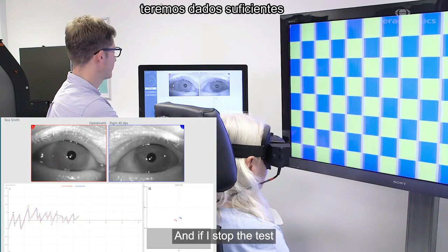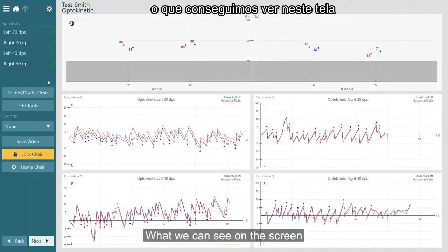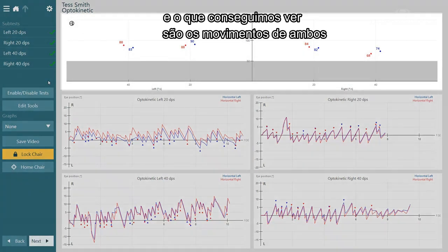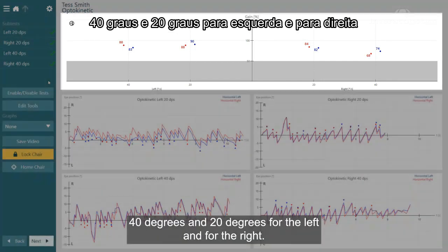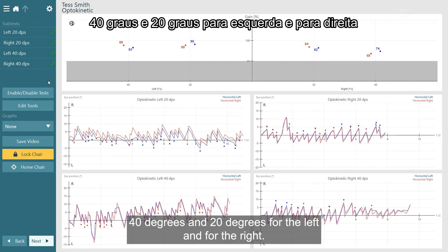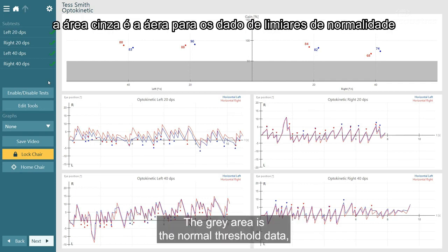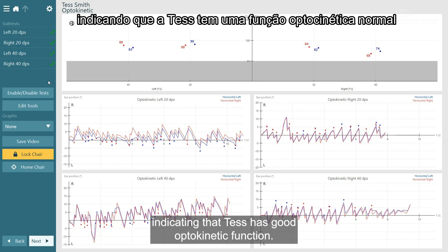If I stop the test here, we have sufficient data. What we can see on the screen is both the raw tracings on the bottom and the gain values at the top. We can see the movements at both 40 degrees and 20 degrees for the left and for the right. The gray area is the normal threshold data, and we can see that Tess's responses are well above that line, indicating that Tess has good optokinetic function.